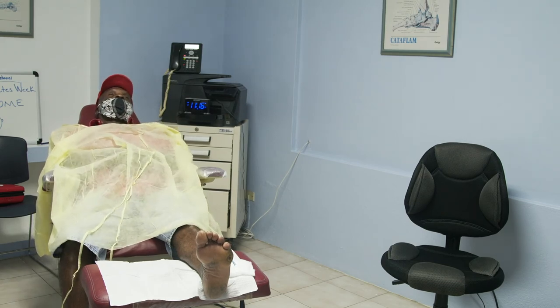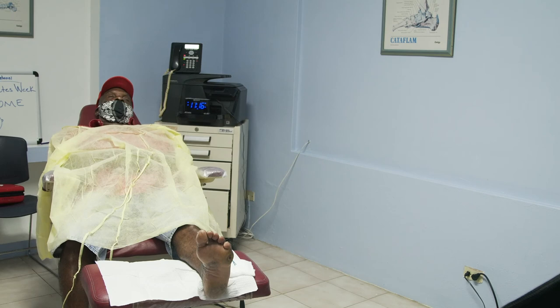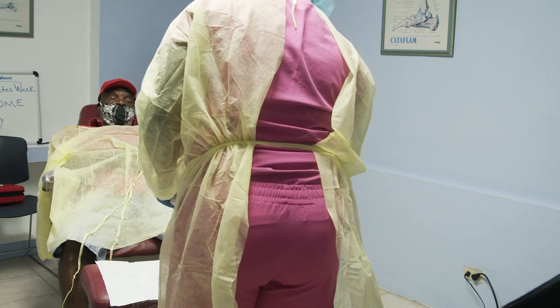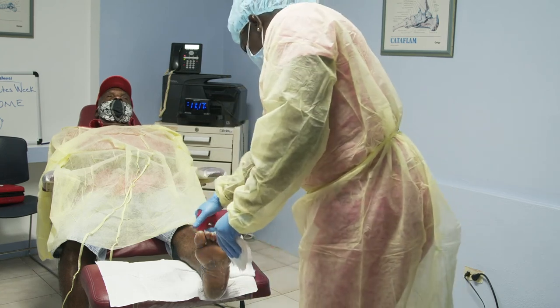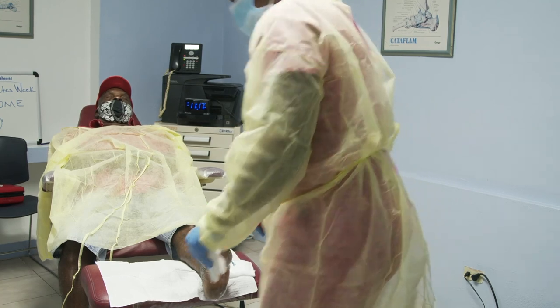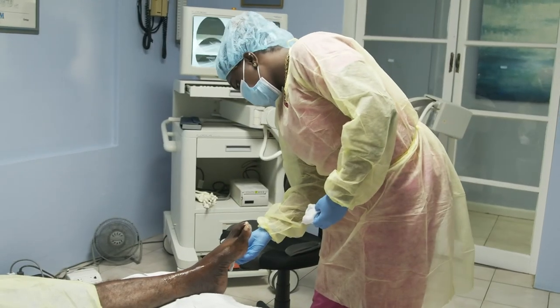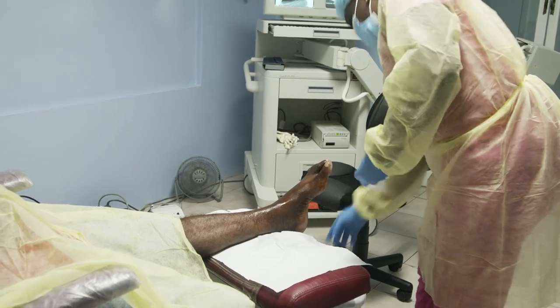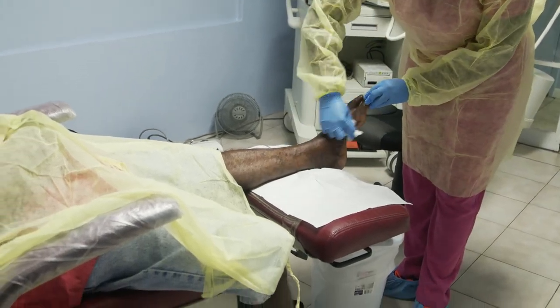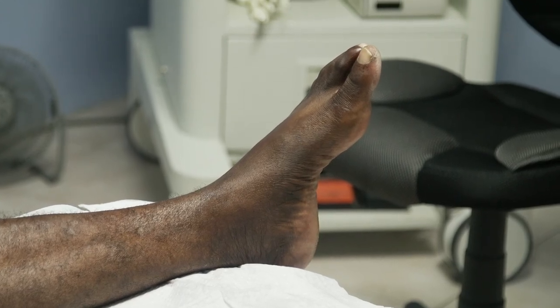Sharps. Hand towel. Felicia, for the camera, you're going to have to turn the flashing part of the machine off in the back. No problem. I'll turn it down. We got him. That's the angle. You ready to go? I want to debride him first, too, if I can get a number 10 blade.